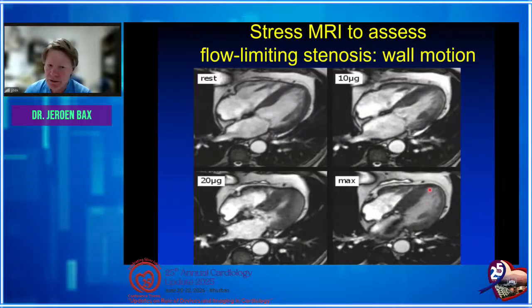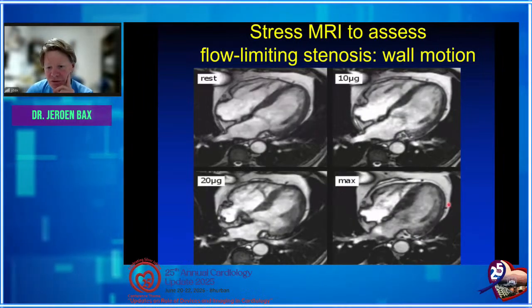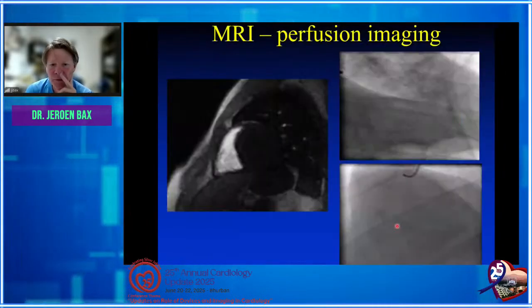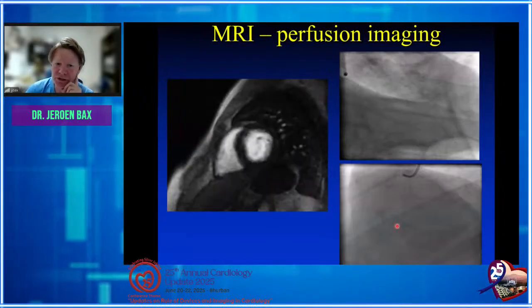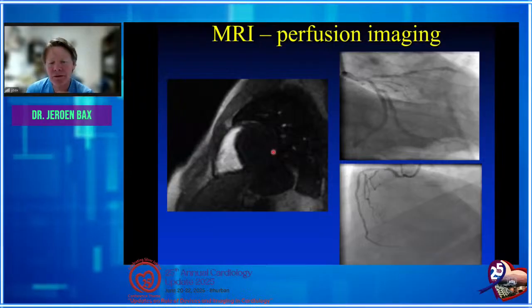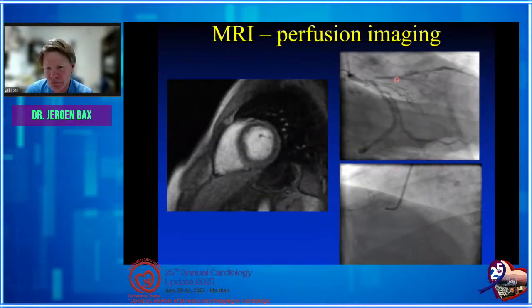It's interesting to see here that if you stress this patient with the pharmacological stress, you see that the patient actually developed a secondary MR. And then we can measure the perfusion. Of course, this is very great material, but this one here shows you that there is endocardial ischemia, and you measure the perfusion defect here. And then when you do the angiogram, you see 3-vessel extensive disease.